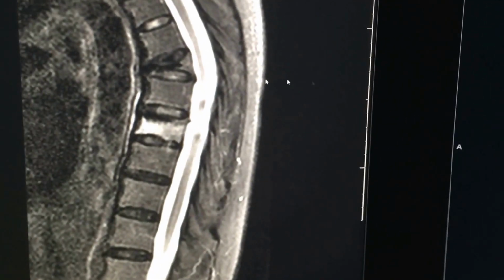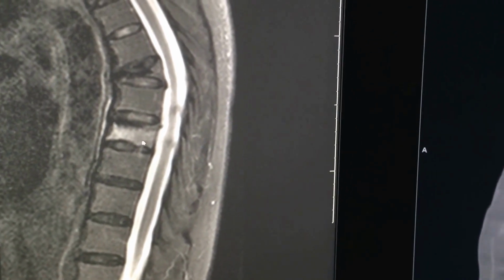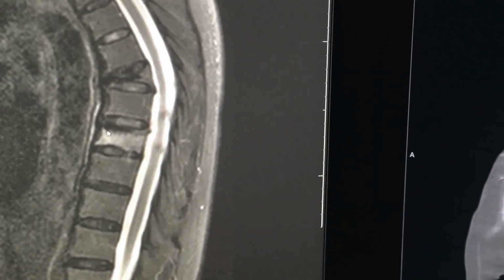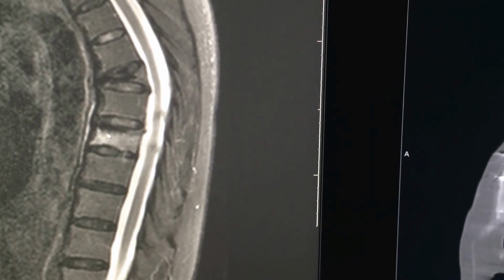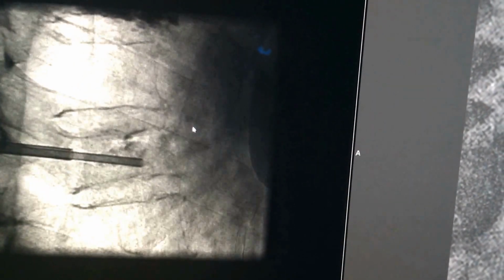On MRI study, that showed this vertebra has edema, so just over the fracture is acute to subacute. But the fracture line is black, basically meaning bone on bone, doesn't have much water in there, doesn't have edema. But still, when the patient is breathing, you can literally see the bones collapsing with each breath.